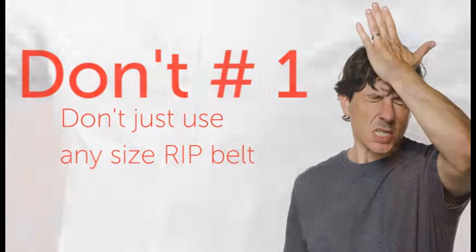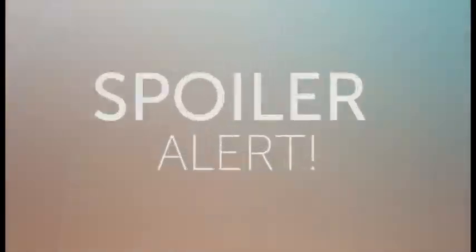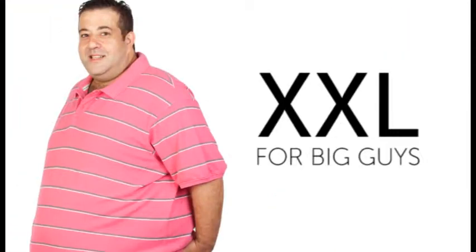Don't just use any arbitrary RIP belt. RIP belts that are too large or too small will not provide accurate measurements, and you do not want to over-stretch the belt. Here's a spoiler alert: RIP belts run small. For adult monitoring, a large size belt is actually best for adults who wear small sizes. An extra large should be adequate for most adults, and a 2XL is for big guys.